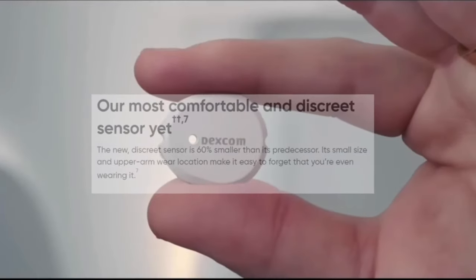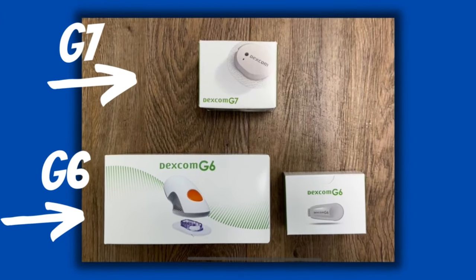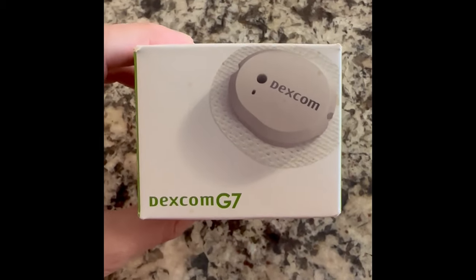The first thing I wanted to talk about is the size. Not only is the sensor much smaller, which most of us already know about, but the packaging is also dramatically reduced. Instead of having two separate large boxes like with the G6 to house both the transmitter and the sensor, the new Dexcom G7 doesn't require a separate transmitter. So they were able to cut down on packaging and put everything in this all-inclusive tiny box.